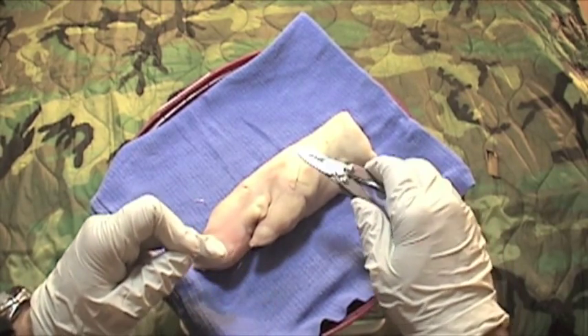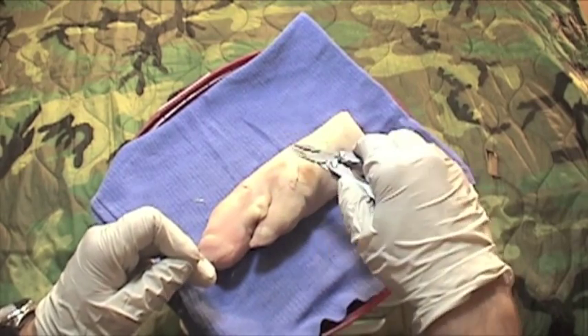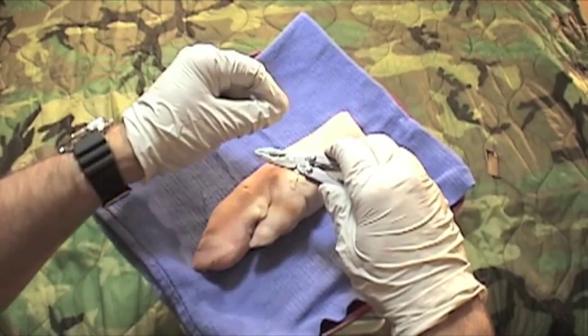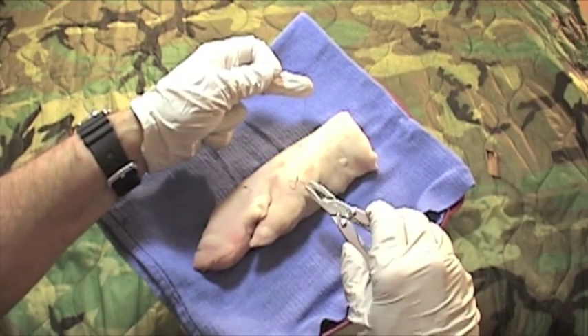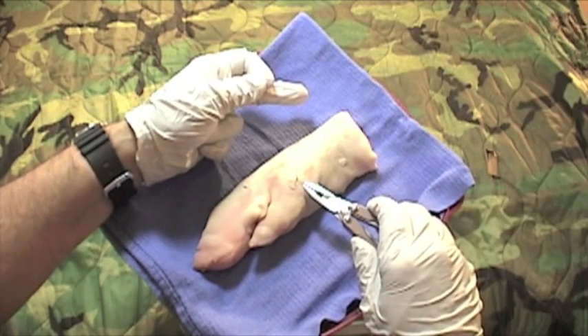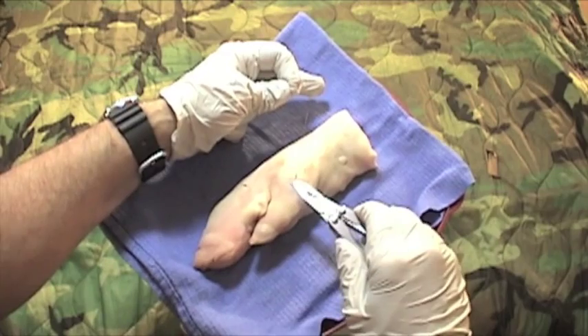That's three — we've got one more to go. Short arm, long arm, V. Needle driver in the V. Long arm over towards short, one throw. Grab the short and pull that knot tight. You may have to reposition, which is okay — we're trying to make the best of things in a field situation.